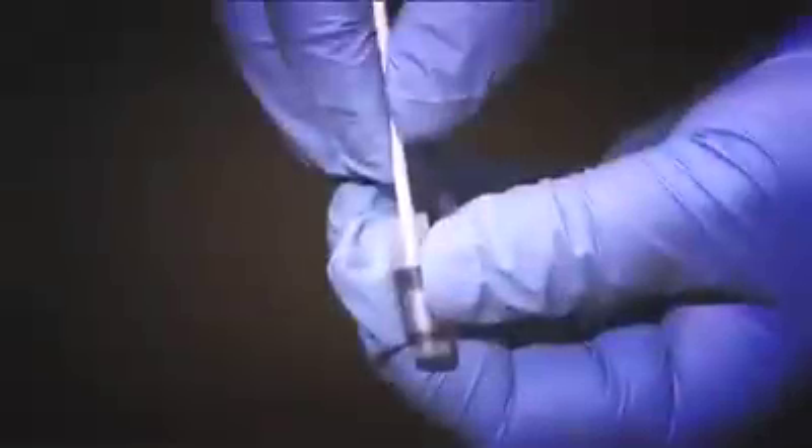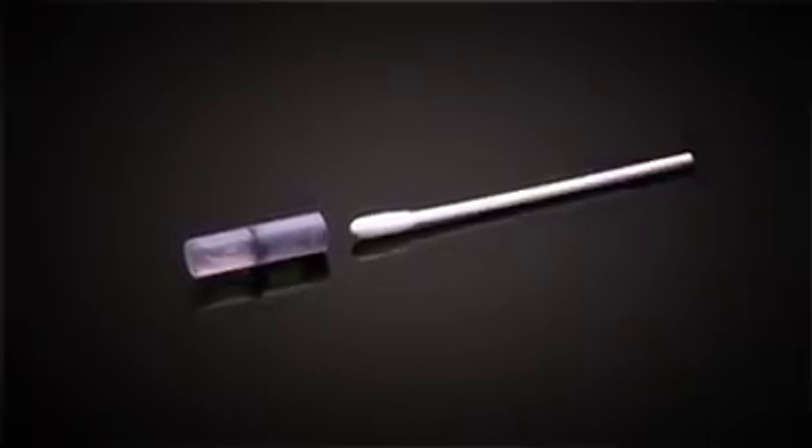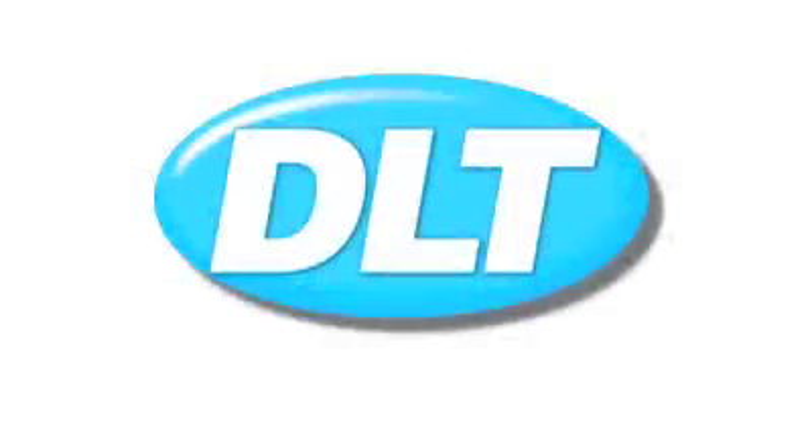Once activated, the swabs soak up the phenol and are ready to apply to the operational site. Easy Swabs are available either directly from DL Townend or on the NHS Podiatry Contract Framework.